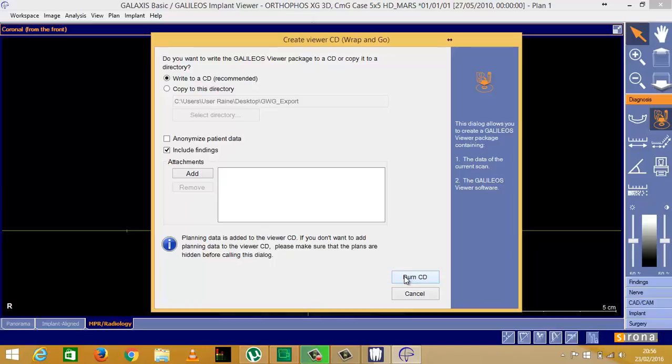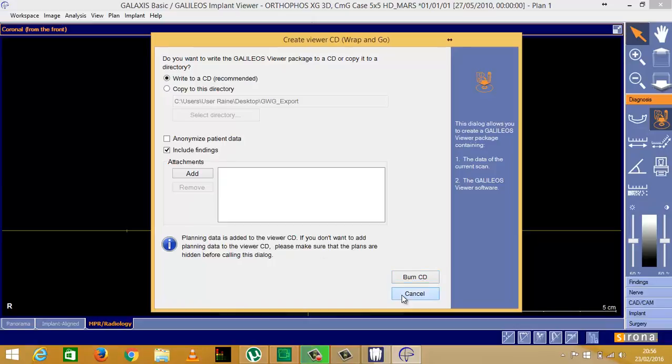And for them to take back to their dentist. If I wanted to, I could copy to a directory, put it on a memory stick, save it to my hard drive, upload it to Dropbox, or send it to anybody, whoever I'm sending my records to. So that's how you do that.